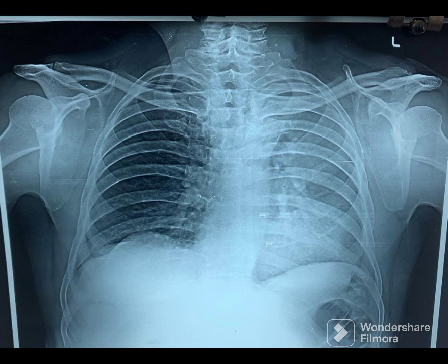This chest x-ray is a bit difficult to interpret. Focus on the left upper zone. You may note that the aortic arch is indistinct or silhouetted, indicating a left upper lobe pathology. A mild tracheal shift to the left can also be seen.